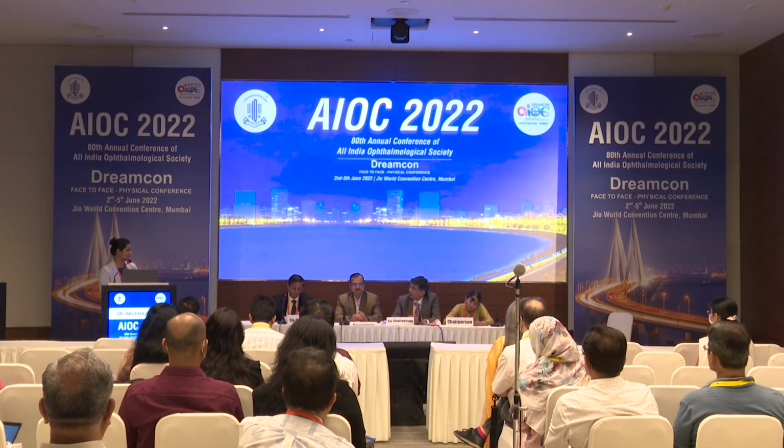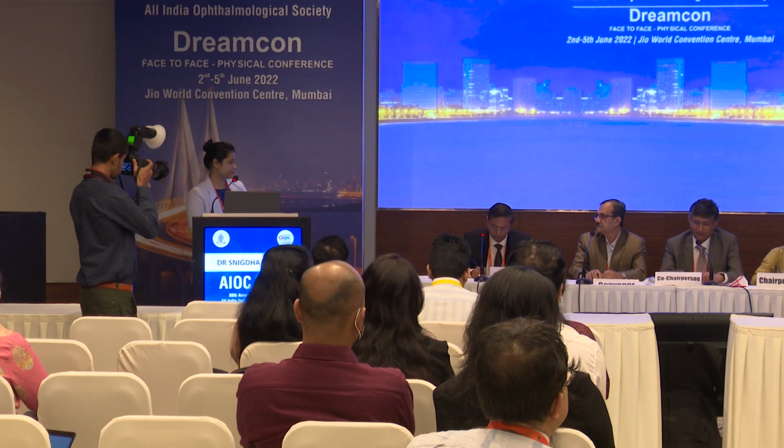Question: did you have any exclusion criteria depending on the refractive error? Yes, sir, the refractive error as such, no, but the best corrected visual acuity should have been 6 by 12. OCT measurements in high myopes can be a source of error. No, sir, that was not taken into account. Yes, sir, that is one point. And image quality? Yes, sir. Image quality, only the scan signal strength of more than 7 by 10 was taken into account.